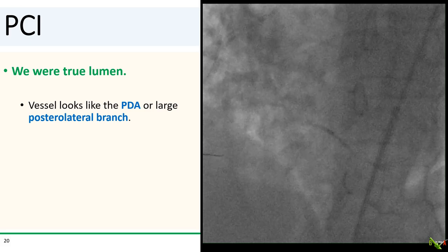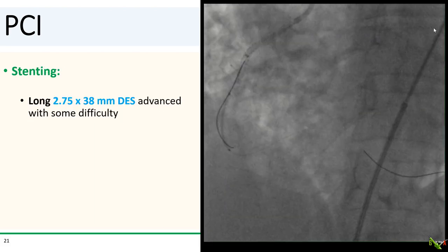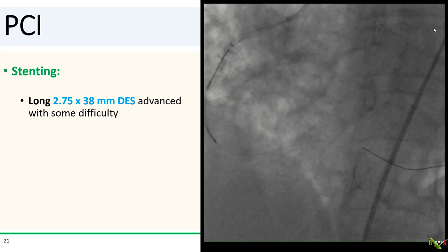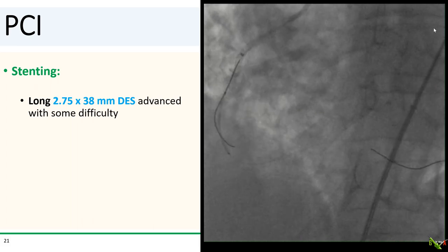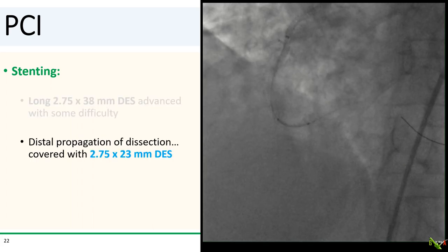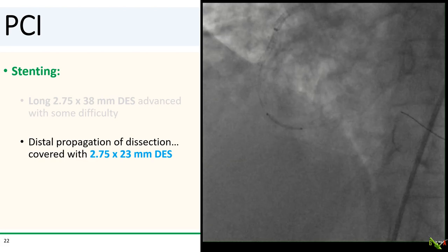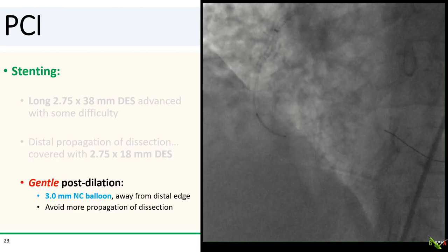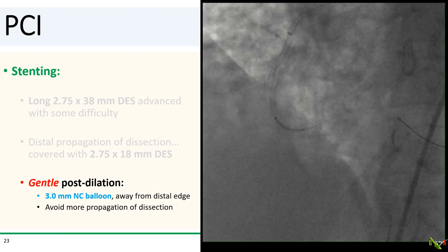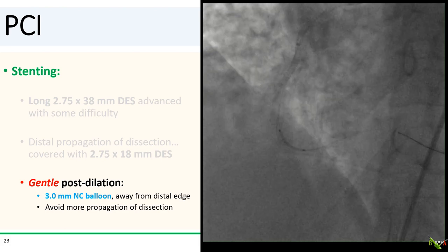And we got it — we're in true lumen. This vessel looks like the PDA or a large posterolateral branch. We then stented the RCA with a long 2.75 by 38 mm DES, which was advanced with a lot of difficulty through the freshly placed stents at the ostium and in the proximal RCA. There was unfortunately some distal propagation of the dissection, which we covered with a 2.75 by 23 mm DES. Finally, we did a gentle post-dilation with a 3.0 balloon, intentionally staying well away from the distal edge to avoid even more downstream propagation of the dissection.